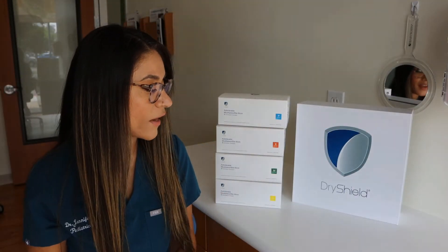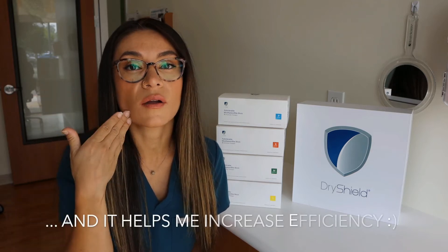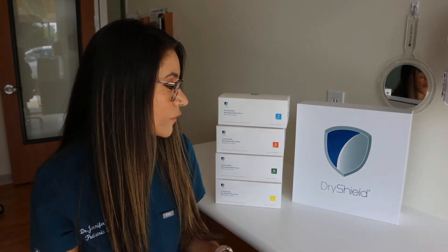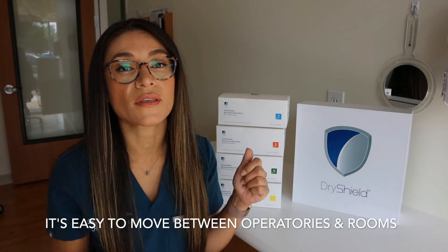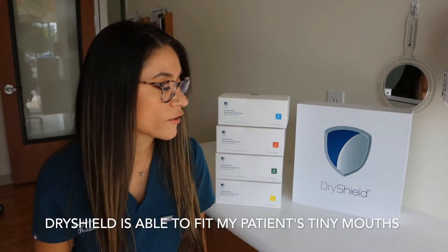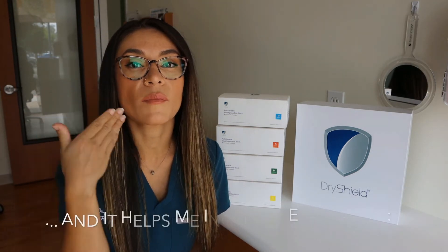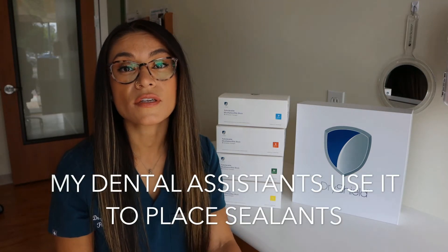With Dry Shield, I've found that we can get a lot more treatment done a lot quicker. I can get two sides done — top and bottom — at one time, as opposed to if I'm using rubber dam, I can only get one side done at a time. I love Dry Shield for that reason. My assistants really love it too; they use it to put sealants on patients. It's very versatile — it's something that we take from room to room and it doesn't take any extra time.